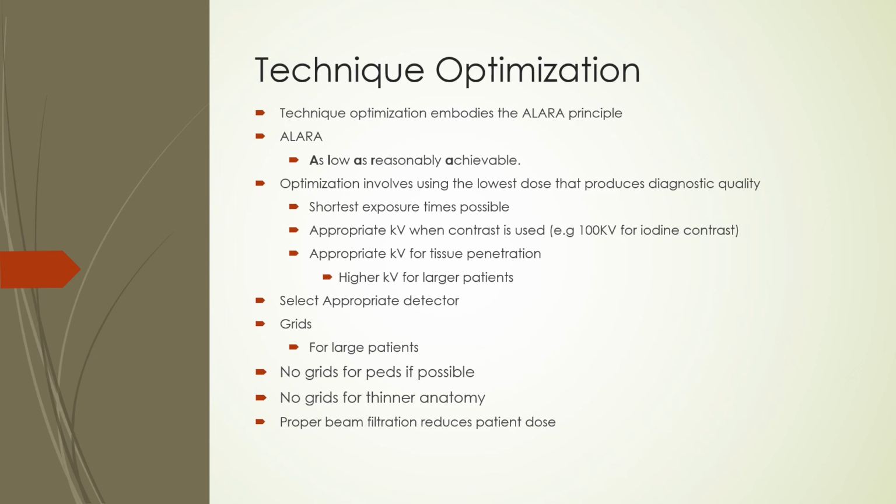Note that for most X-ray tubes, the kV and mA are connected by the maximum power available for the tube. So for a 10 kilowatt tube, if you select 120 kV, the mA available will be limited to about 83 mA. So it is important to keep in mind the trade-off between kV and tube current because of tube power limitations.